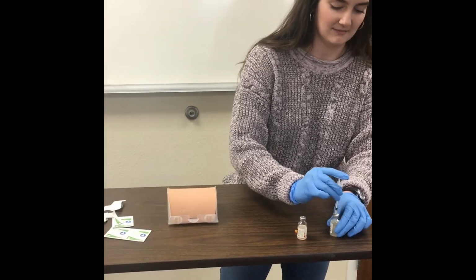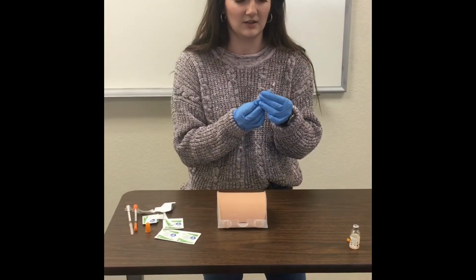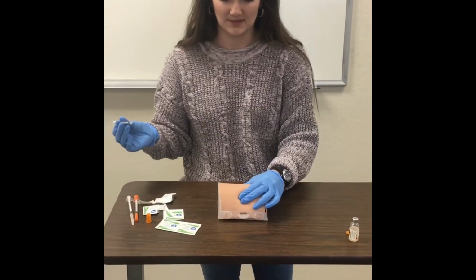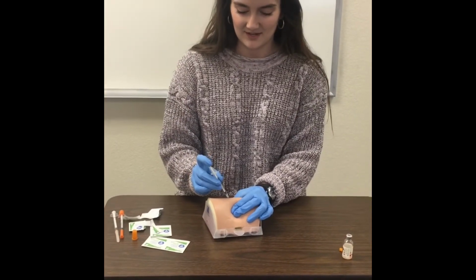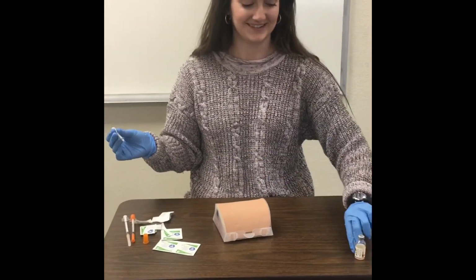If my needle did bend, I would go get a new one and do this all over again. Then I'm going to pinch up the skin and inject at a 45 or 90, but we're going to do it at 45. We're going to go in, inject, and then wipe off any blood.